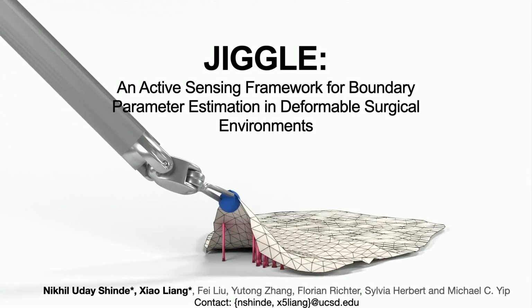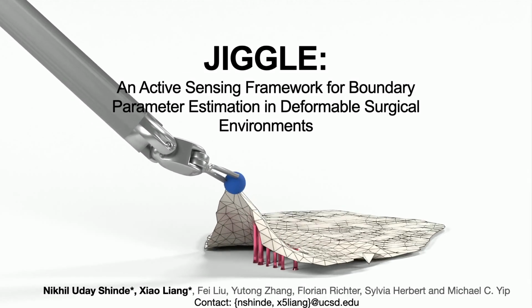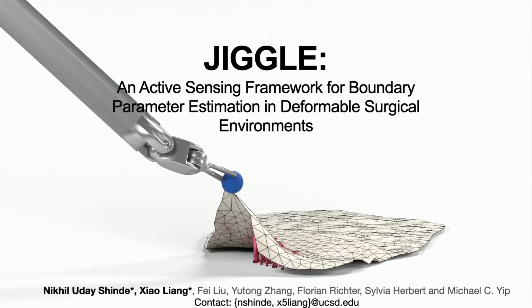I'm a PhD student in UC San Diego, and today I'm presenting our work, JIGGLE, an active sensing framework for boundary parameter estimation in deformable surgical environments.